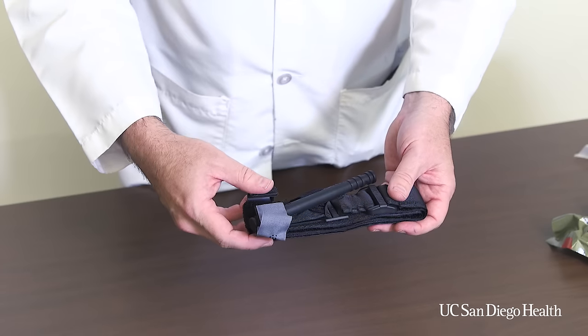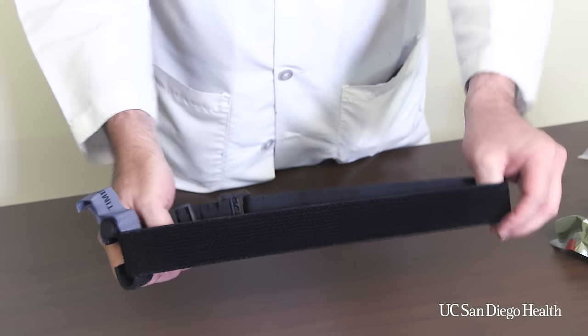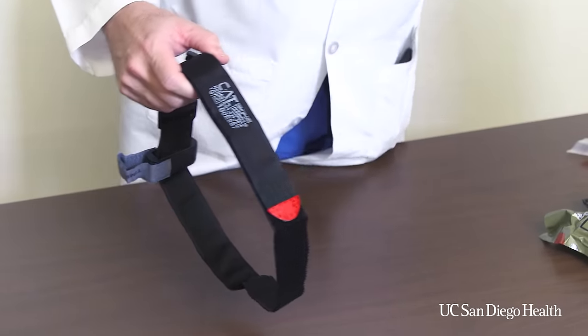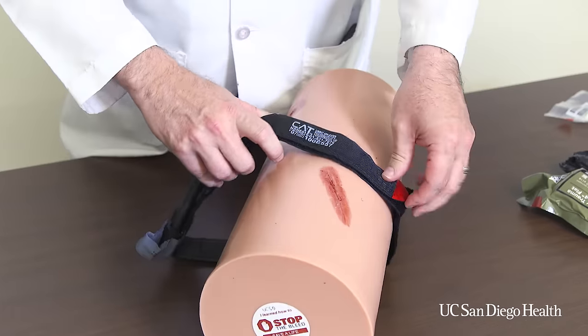To use the tourniquet, we need to first open it up. If we simply take two sides of the loop and pull, the tourniquet will open up into a nice big loop. In this way we can put the tourniquet over the end of an extremity, simply by putting the extremity through the loop.